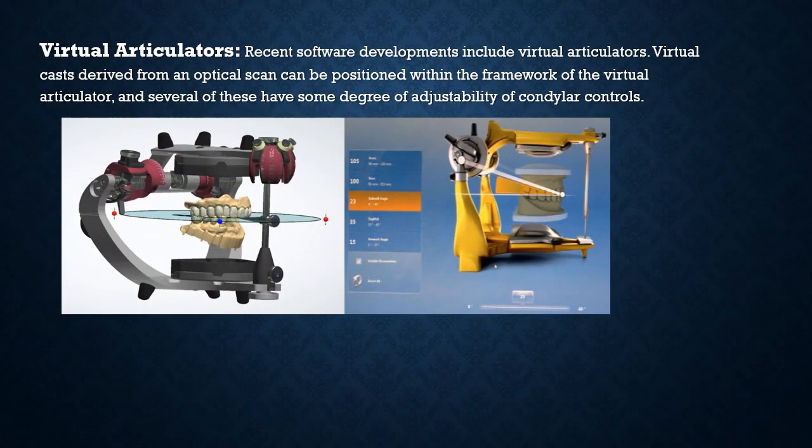Well, recently there are the virtual articulators. So recent software development includes virtual articulators. Virtual casts, usually derived from an optical scan, can be positioned within the framework of the virtual articulators, and several of these have some degree of adjustability of condylar control.